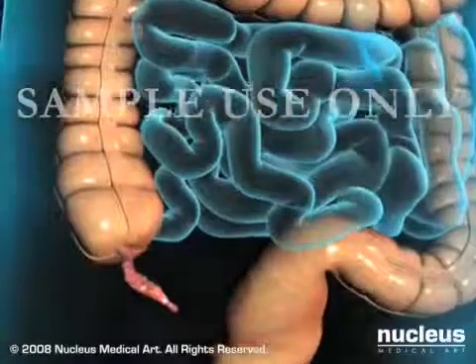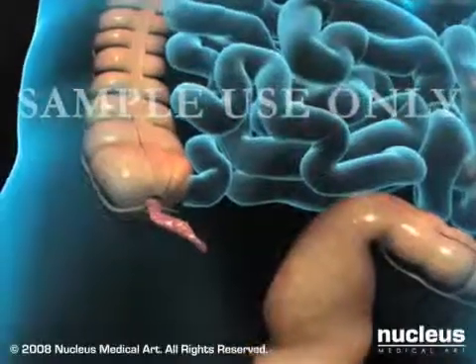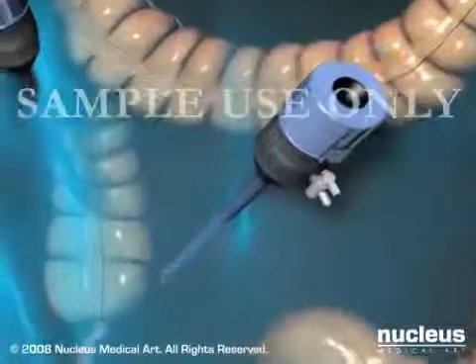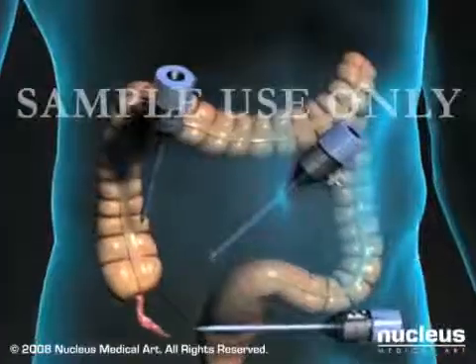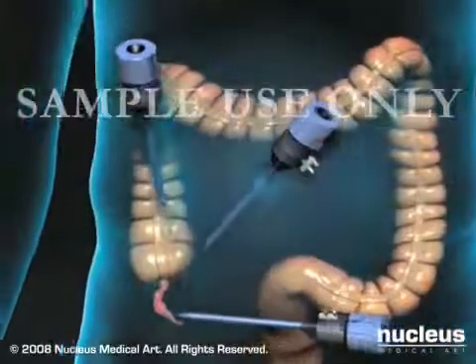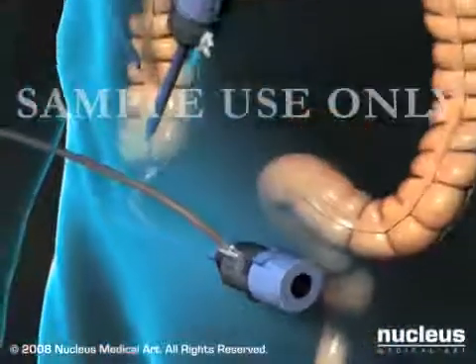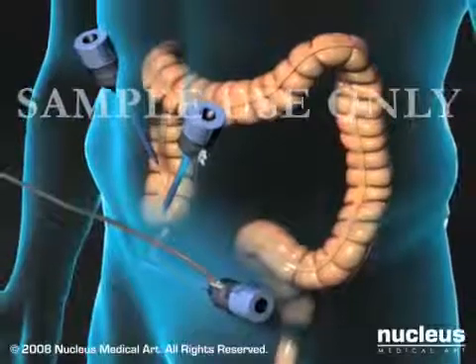An uncomplicated laparoscopic appendectomy usually takes between 20 and 30 minutes. To gain access to your appendix, your surgeon will use sharp instruments called trocars to create 3 small holes or ports through your abdominal wall. These ports are usually located at your navel or umbilicus and in the upper right and lower left quadrants of your abdomen. Carbon dioxide gas will then be pumped through the umbilical port to puff up your abdomen so its contents can be viewed more easily.